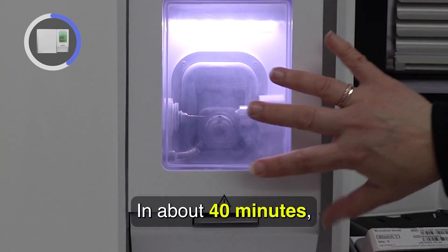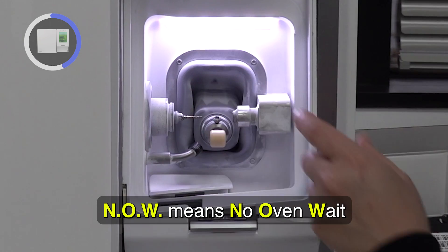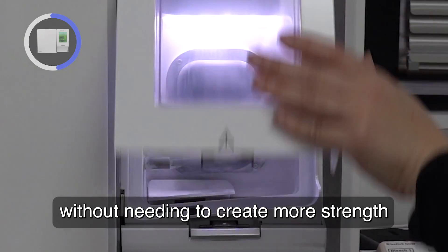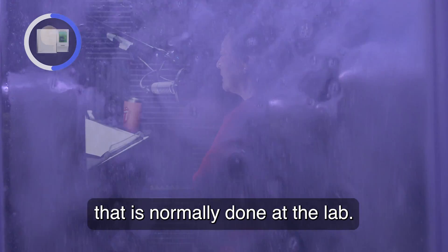In about 40 minutes, a fully-milled BruxerNow crown is made. 'Now' means no oven wait, so I can deliver this crown same day without needing to create more strength through an oven-sintering process that is normally done at the lab.